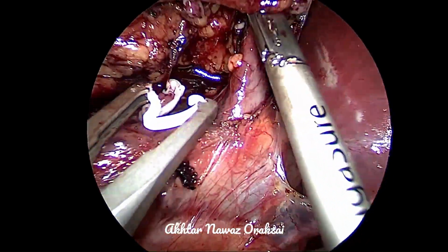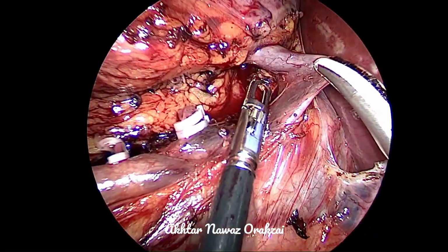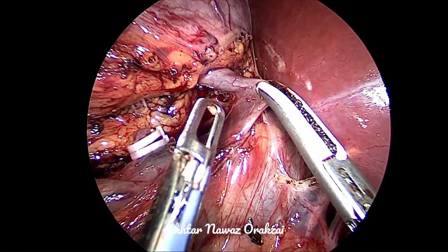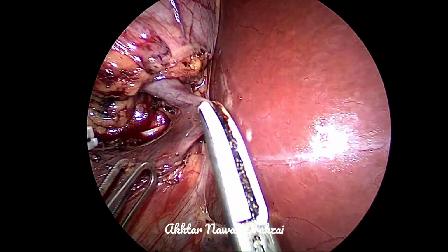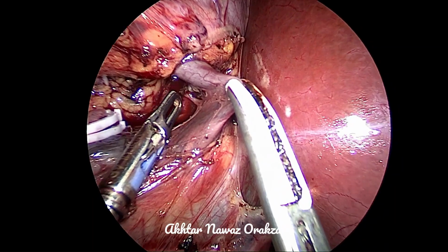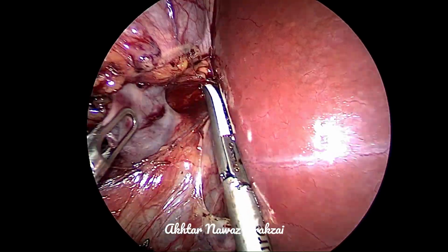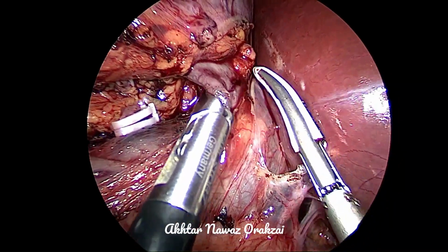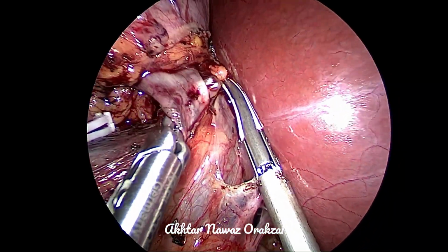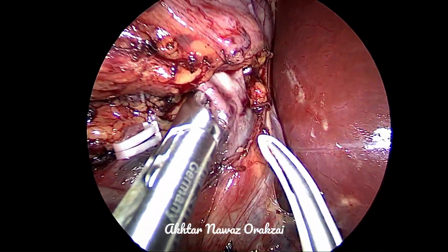Here we applied this clip, so we are now satisfied. You can see the color of the kidney has changed. The vein diameter has become a little smaller, and the vein has collapsed. So this gives us some bit of satisfaction that we are going in the right direction. So then we dissect the vein completely by using the 10 millimeter right angle forceps.